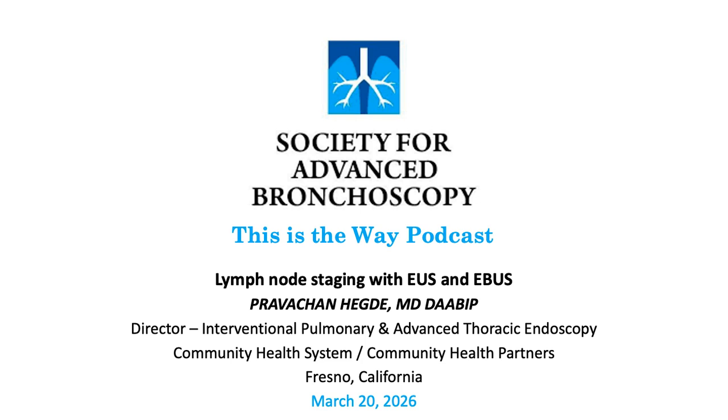The classic approach that Jensen in Europe described in his paper was, when you just start, to learn the 6 landmarks for EUS, first based on simulator-based training, which might shorten the learning curve, and then it can ensure some basic competence before unsupervised performance.